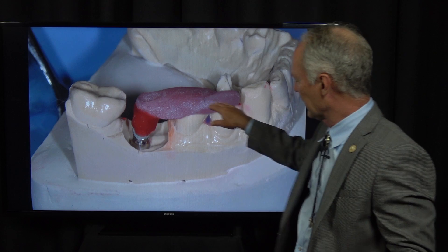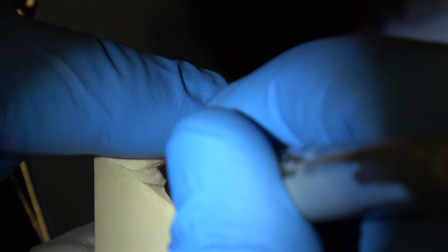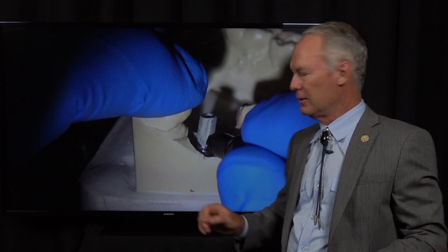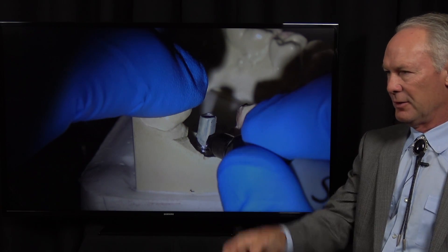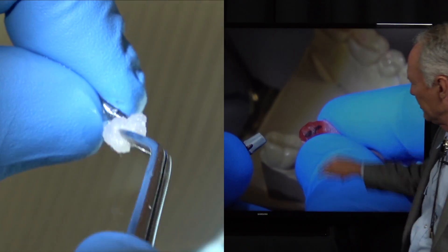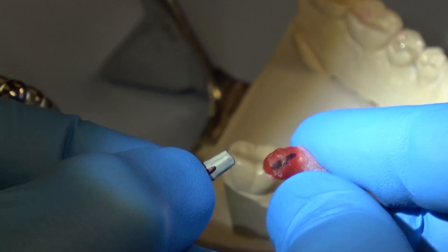This is Duralay, and it's a guide for seating the implant abutment. I always like to mark a black mark on the Duralay and then put a similar mark on the abutment — sometimes it's hard to see that little groove in the mouth. So I put a black mark, and when I'm lining things up in the mouth, I can see those marks. The black mark on the Duralay guide is lined up with the black mark on the implant. Then I clean it with isopropyl alcohol. This line is going to line up with that line — so just in case it would fit another way, I know it's lined up correctly.